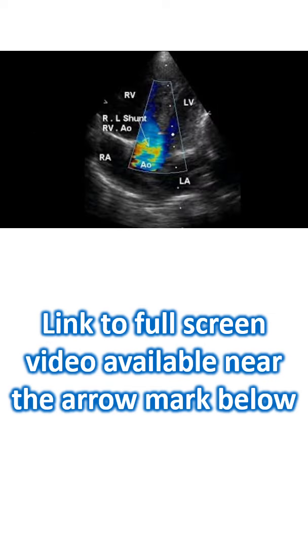Apical 5-chamber view in Tetralogy of Fallot demonstrating the subaortic ventricular septal defect with aortic override. 50% of the aorta is committed to the left ventricle, while the remaining half is committed to the right ventricle.